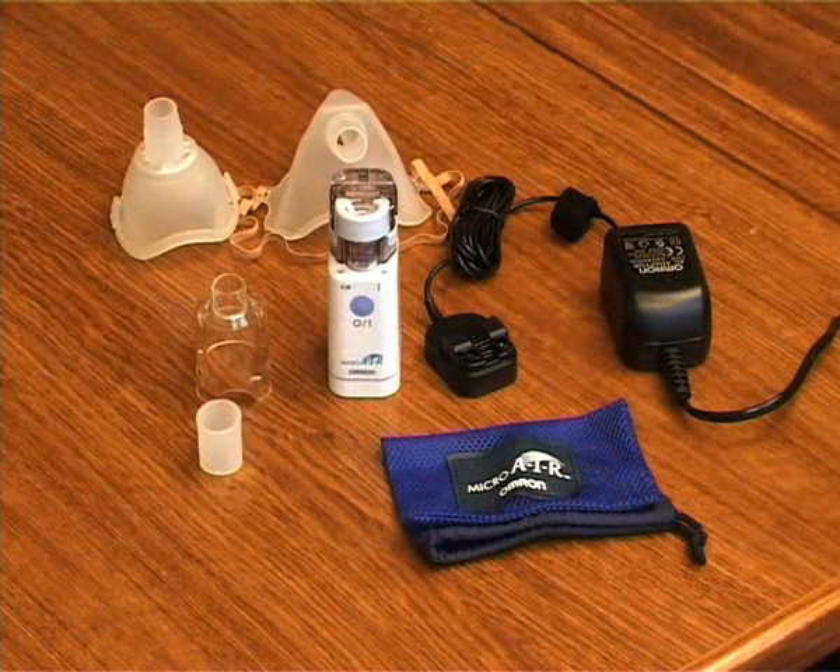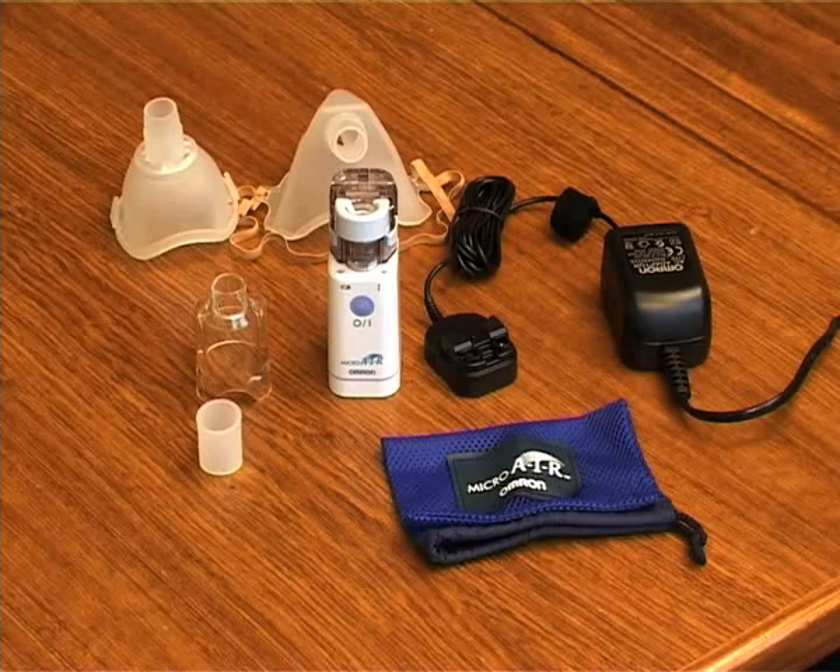The NEU22 comes complete with the main unit, medication bottle, mesh cap, mask adapter, a mouthpiece, two sizes of mask, and a storage bag.